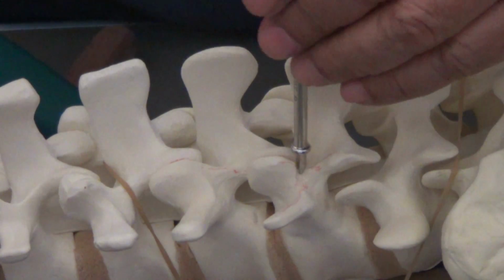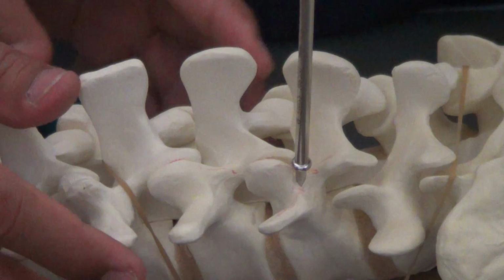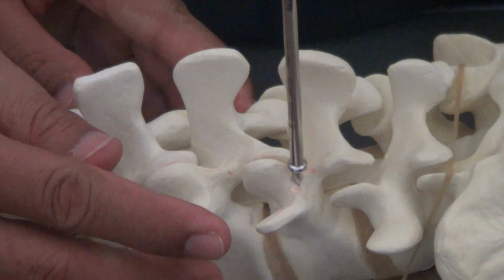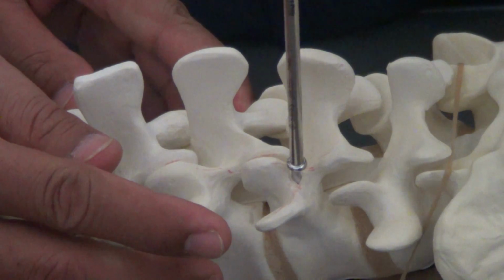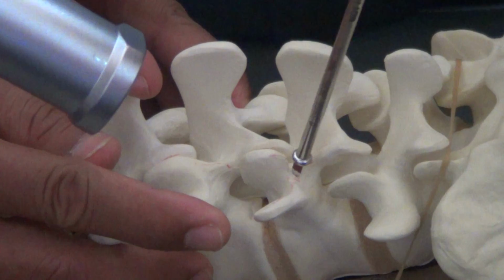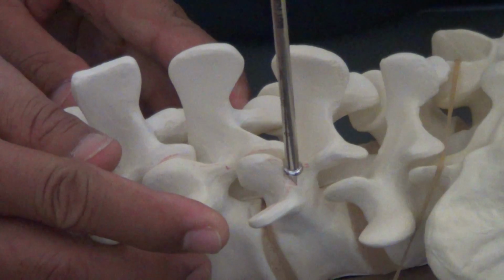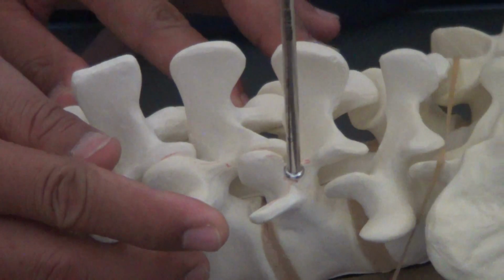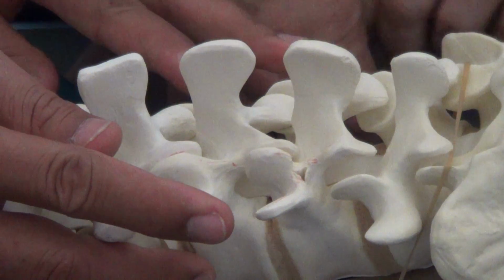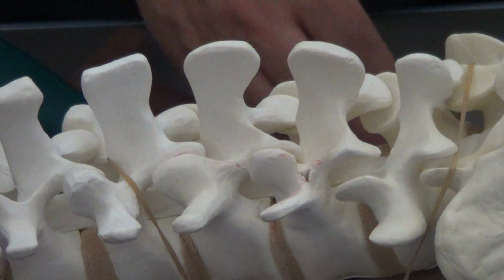Then you enter there, straight in there, and you can use a hammer. Angulate it, you need to angulate in this direction and this direction, right? So 15 degrees, and you go straight, and you go straight. That will make you an entry there. This is about 10 millimeters. So that's half the pedicle.